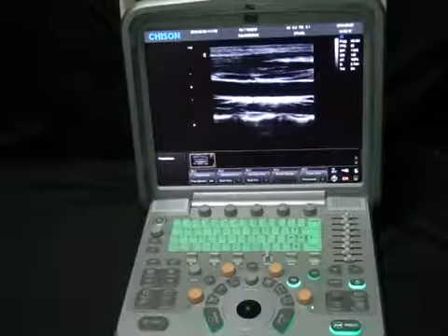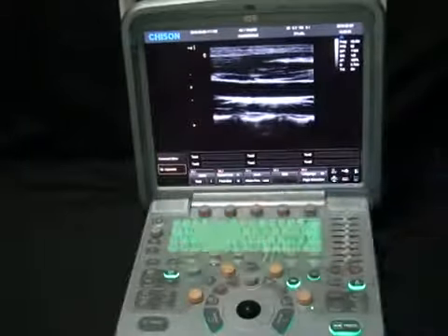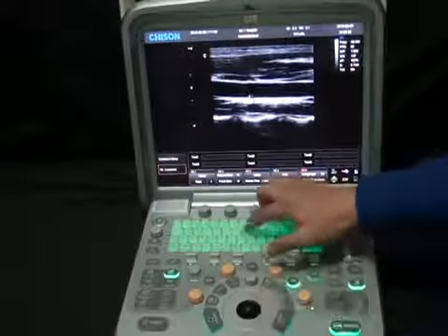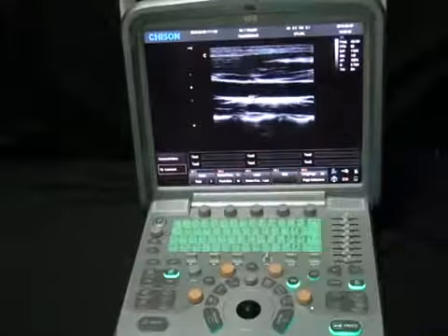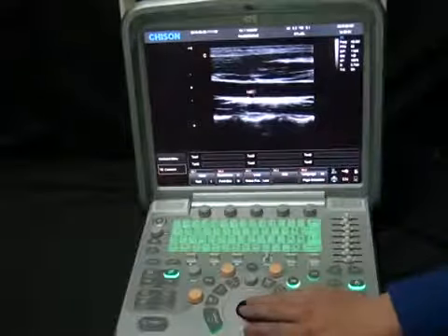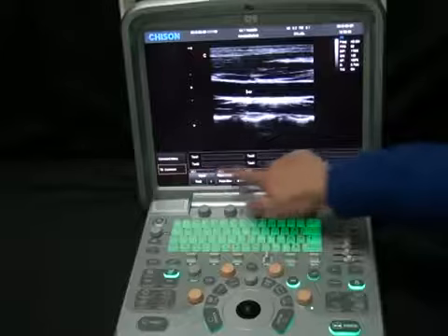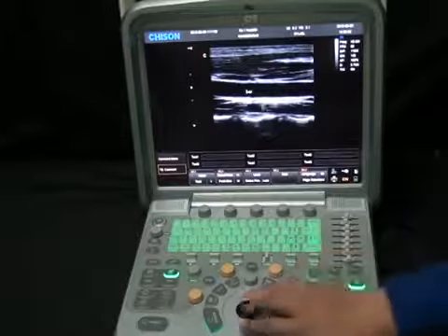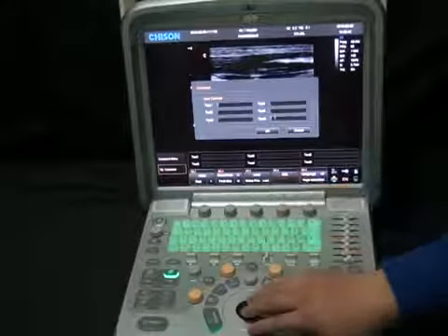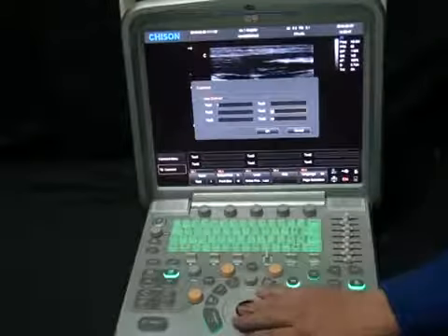If necessary, we need to do some annotations. Press the Annotation button to enter annotation mode. We can type text directly. You can use backspace to delete, and move the trackball to reposition it, then click Enter. We can also add quick comments. Click Edit to add up to 6 custom comments for quick use. Enter the comment text here and click OK.